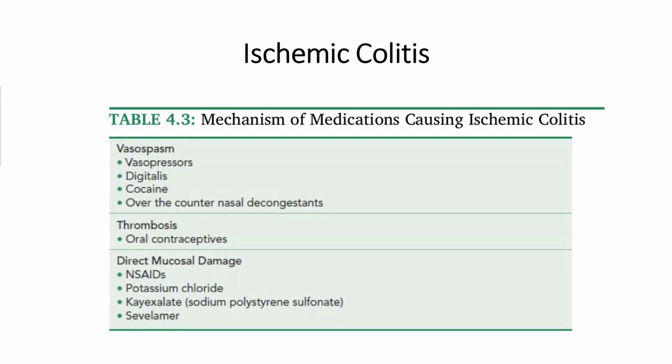Some of you wouldn't expect that we will put the non-steroidals as one of the mechanisms, or one of the pictures that it will present itself as, is ischemic colitis. Oral contraceptives, so all of those can cause ischemic colitis, and this is what we fall short on, right? We look at the area of hemorrhage, the edema and the stripping of epithelium and say it is all traumatic, procedure related.